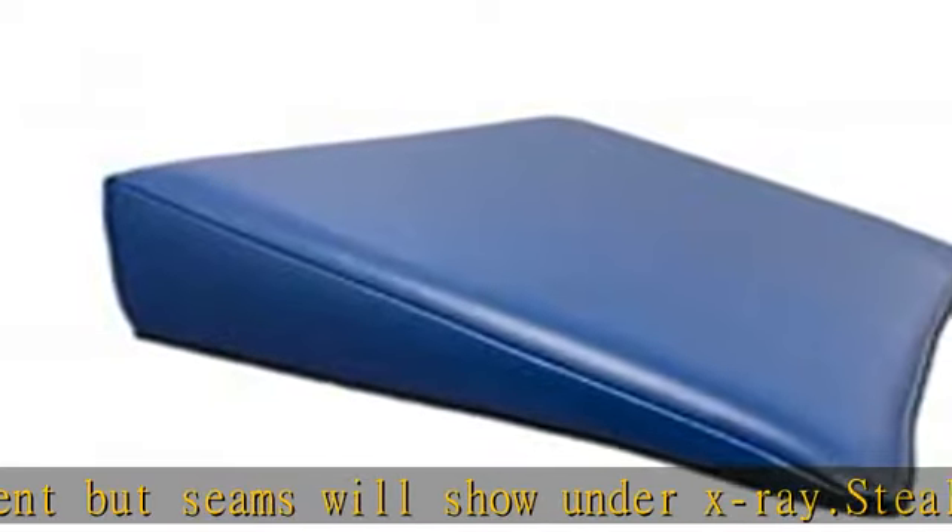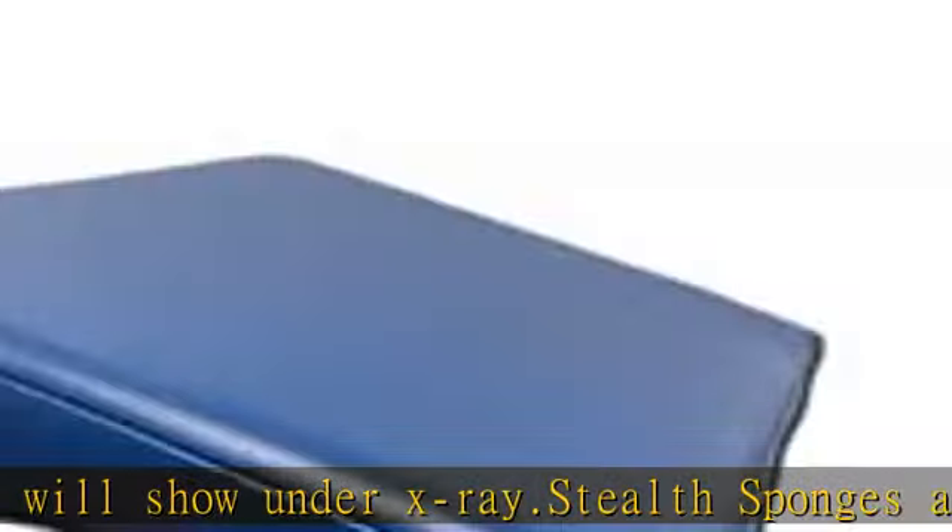Most returns can be made within 10 business days from delivery. Standard positioning foam products are not returnable.